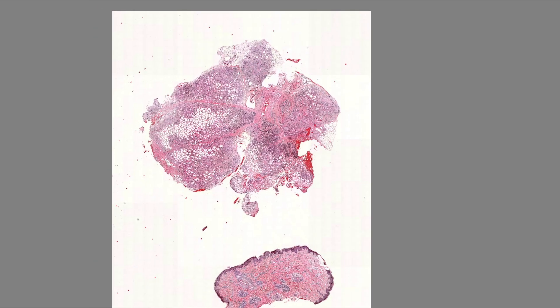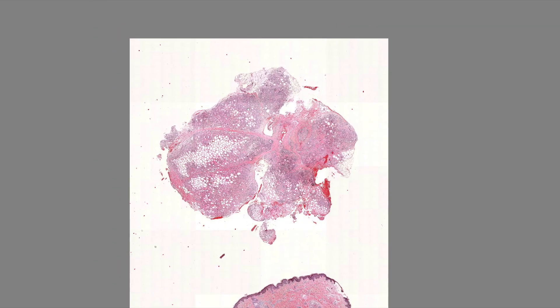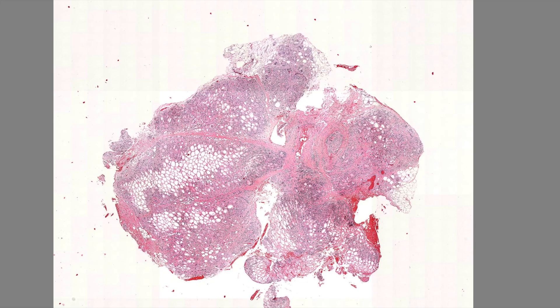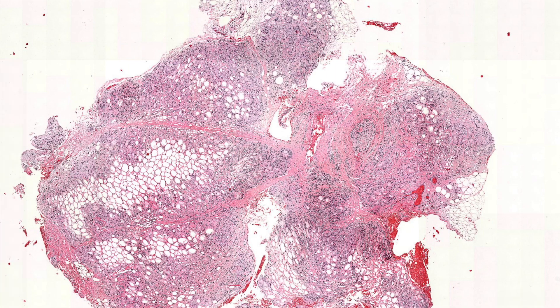A pretty big piece of tissue here, and I can see the fat with a lot of inflammation around it.